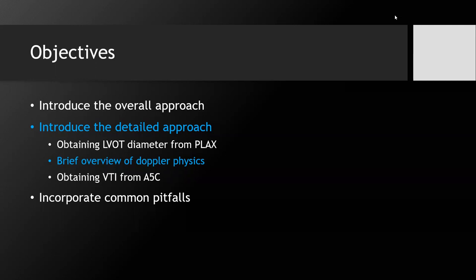And then you wouldn't really be able to, you could try, because there are markings on the side of the sectors, right? It's a good point. Where you can sort of see how many centimeters something is, but you're going to be doing a lot of guesstimation unless you have calipers. And then you can lead yourself astray, but it's a good thought. I guess it's something you could certainly look at and try to get a sense of if you think that they're around the 2 centimeter mark, but can't fully advise using that if you're going to be making fine assessments. Great thought, great question.